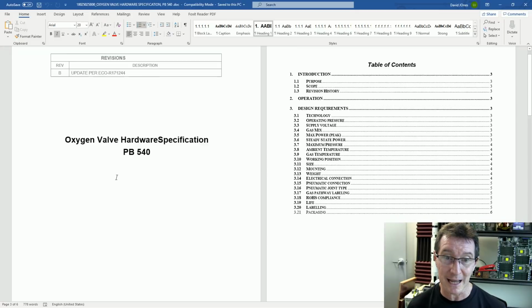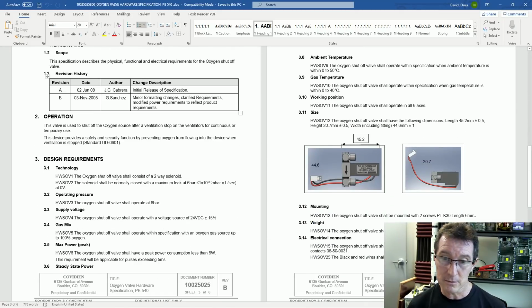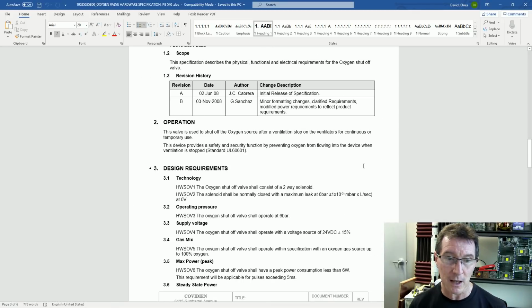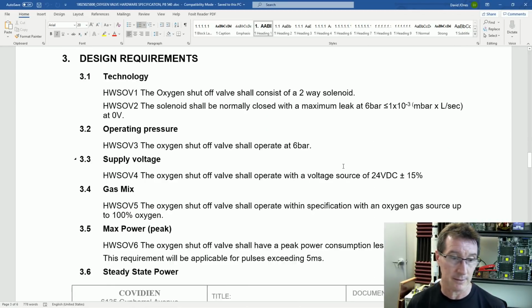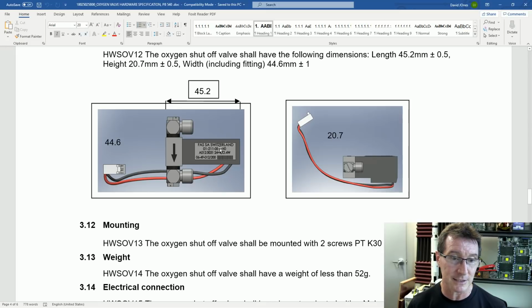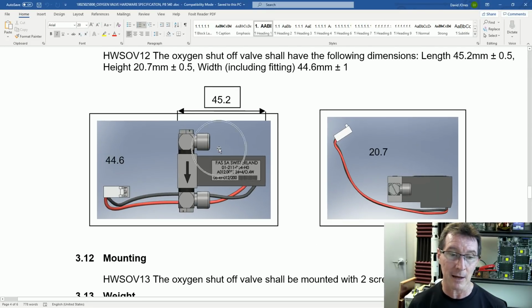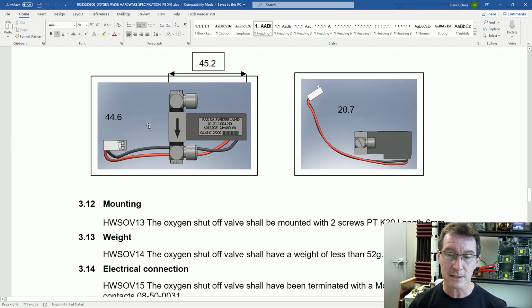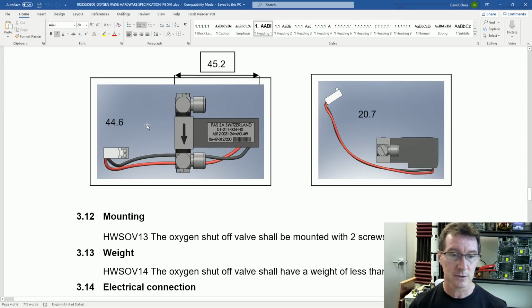I assume it's a custom thing, is it? No, Switzerland. No, it looks like a Folsa. Folsa in Switzerland. I assume that's a company that makes these. There you go. Is that the part number? If that's the case, beauty. If you can get all the sensors and stuff off the shelf, that's absolutely fantastic. Well done, Medtronic. So there you go. But once again, if you download this information, you agree to that license.